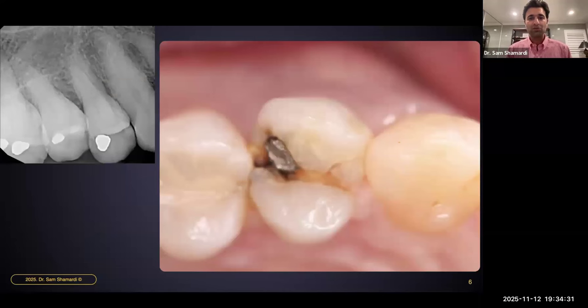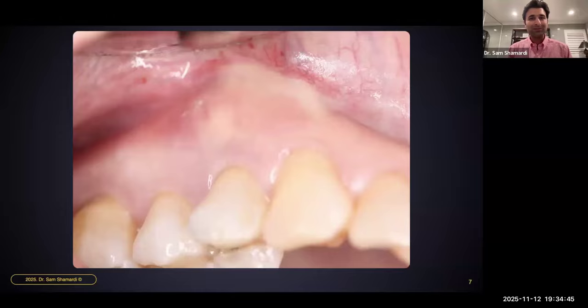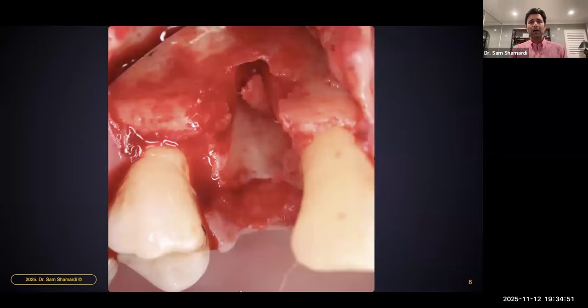We'll look at a case like this and we'll see there's a fracture, there's some mobility on the tooth radiographically. We'll think, well, I don't really see any lucency there. This should be a quote unquote easy extraction, always a fatal last word, famous last words to say. And then, of course, we start seeing things are a little bit different. We see a little bit of puffiness, swelling in that tissue. And sure enough, by the time we extract these teeth and we start learning about how we're going to raise flaps more efficiently and extracting and cleaning out all the infection, we start seeing we've got significant impacts there on the bone. We've got significant bone defects, which we're going to specify in just a moment. And we start seeing that these cases are a lot more complex than maybe we bargained for.